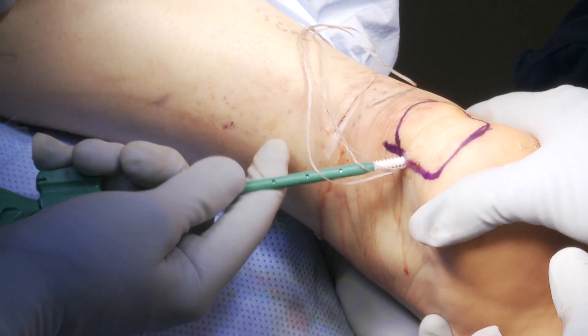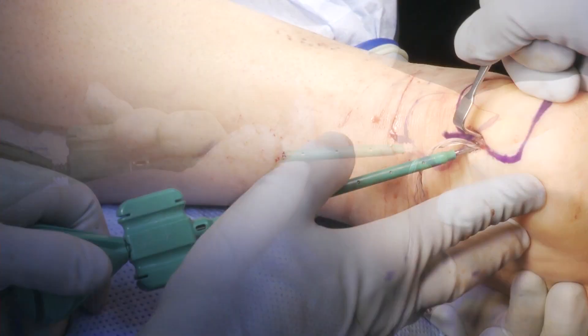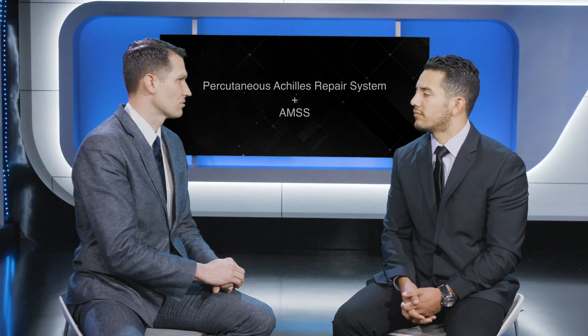Things that I've done to make sure that I don't have some of the pitfalls that can come with any surgery — pain around the incisions, those kind of things — to minimize those secondary effects is making sure that the swivel locks are countersunk into the bone. I try to avoid the traditional dead man's angle and I come in at about 30 degrees into the calcaneus right at the margin of the Achilles insertion under the calcaneus. Making sure that the swivel locks are not impinging on one another but are off axis to a small degree has really led me to do dozens of these without any negative side effects.